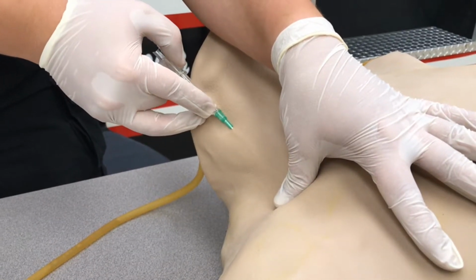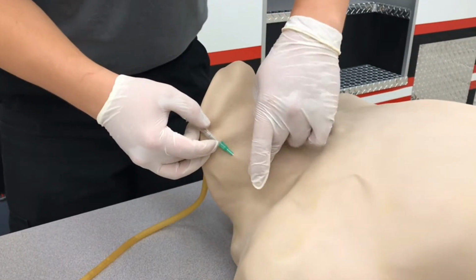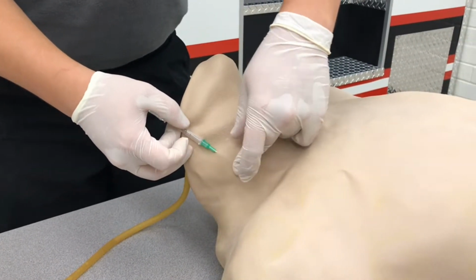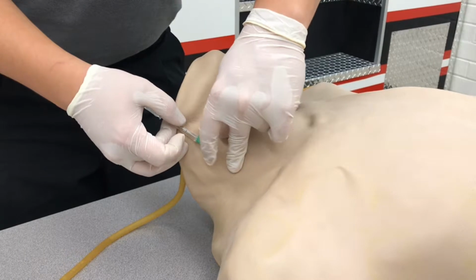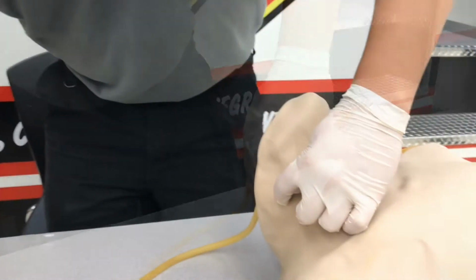We're going to lock this back in place, and we're going to tamponade. So make sure that you're tamponading really well, because there is a risk of air embolus if you let go. I'm going to take that off and put that directly into the sharps.